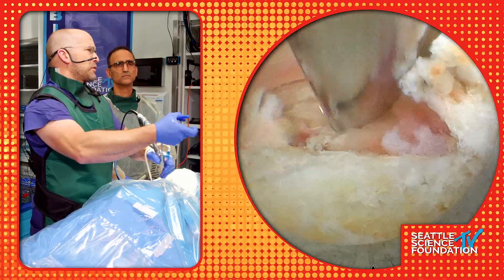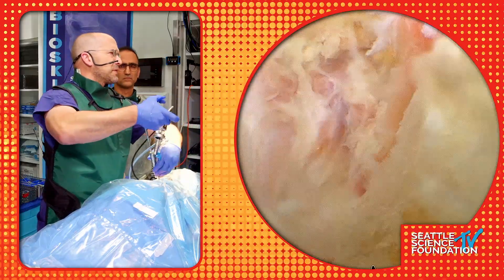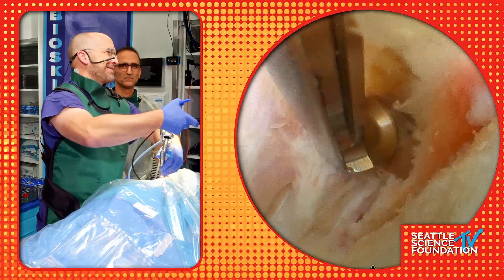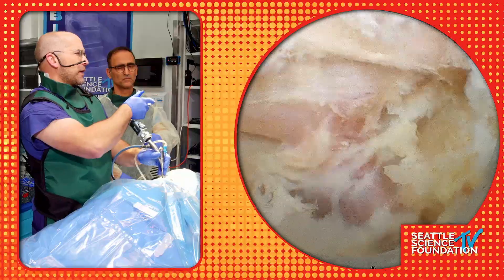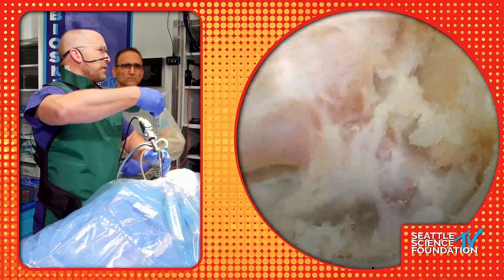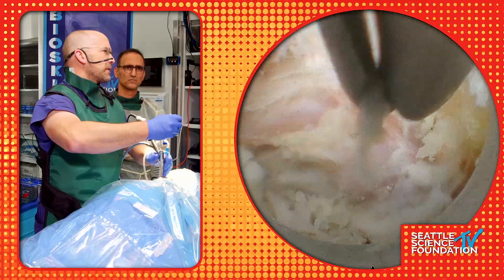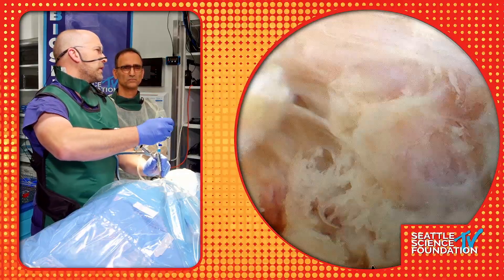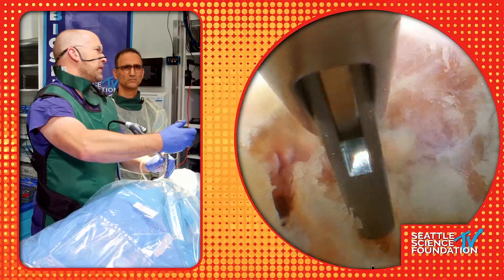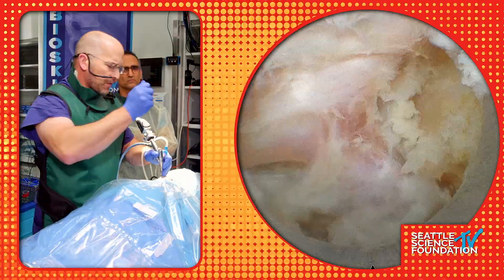Should be one of the last bites — famous last bite. Here's the foramen out there, here's the nerve root. You know sometimes the hardest part of the operation is knowing when to stop. I just want to micro-punch — it's just cosmetic. We've now done a complete foraminotomy. I'll take off these little ligaments. In real life you would take all the ligaments off — well actually no, you leave them. One thing is in real life you sometimes have ventral osteophytes. Using a blunt dissector now — we're done with our foraminotomy.